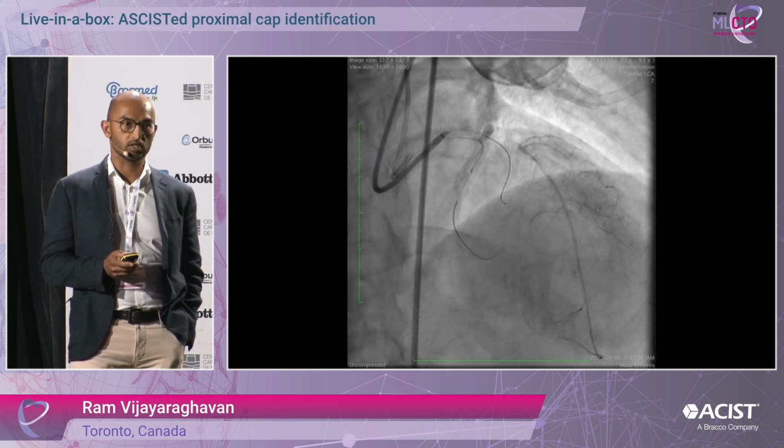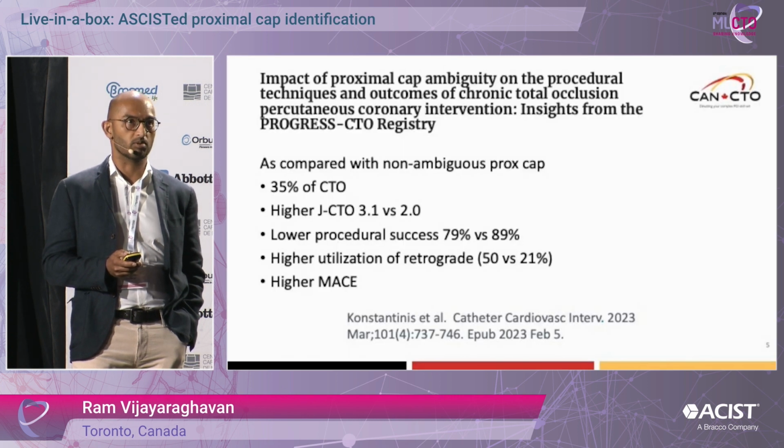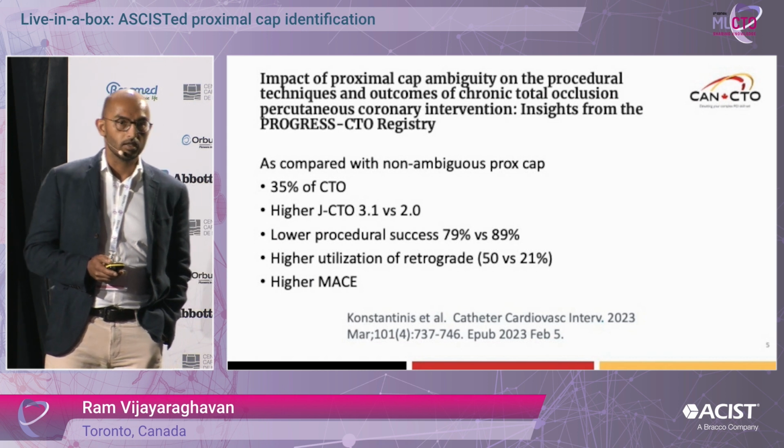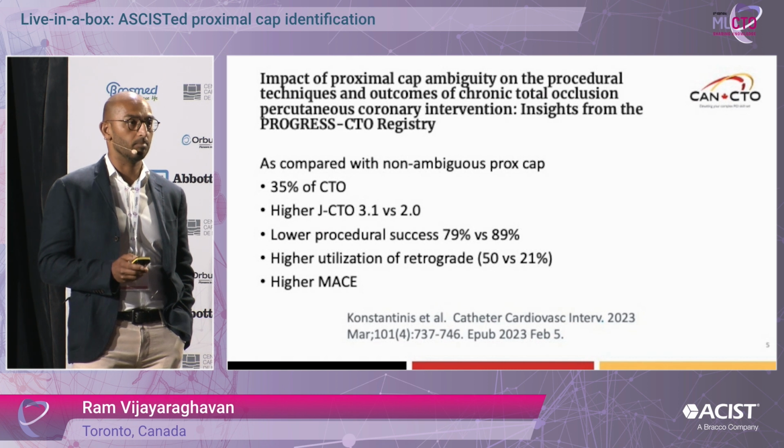Seems like a relatively short CTO, not particularly calcified, but within a segment of approximately 2 centimeters, we don't know where the proximal cap is. The impact of proximal cap ambiguity on our success and failure can't be understated.